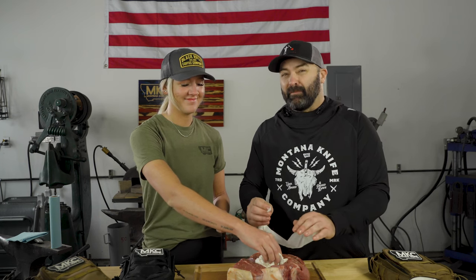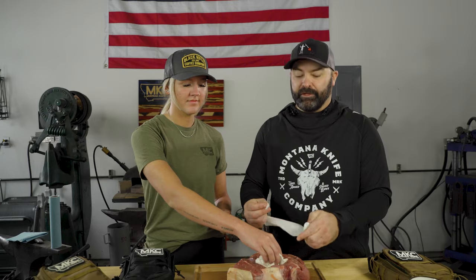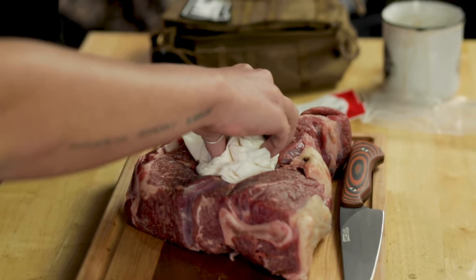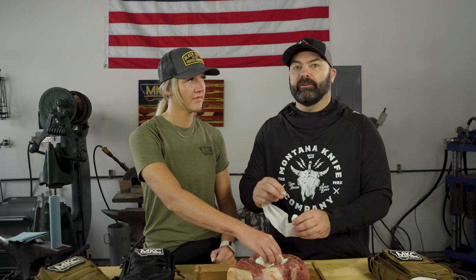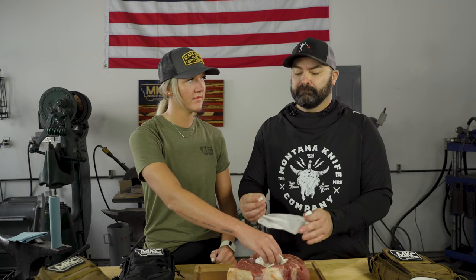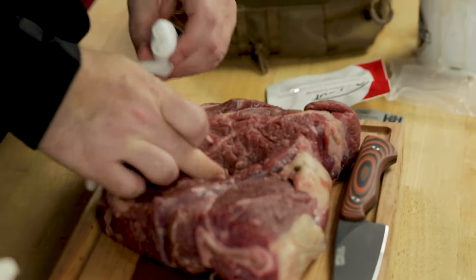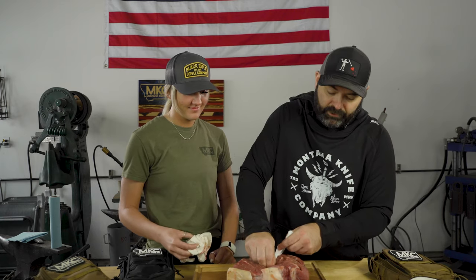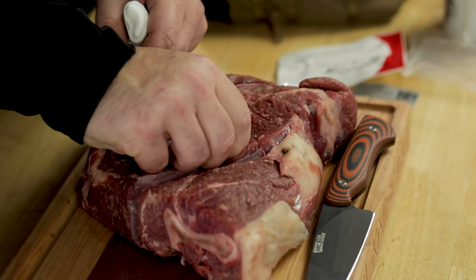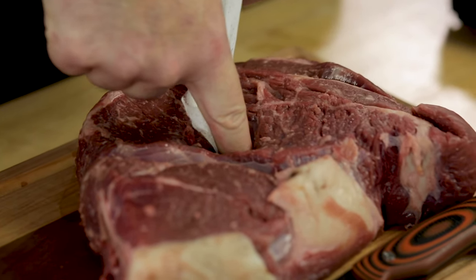Sadie is doing an excellent job of mopping up that blood and putting pressure on there to keep it from bleeding more. She hasn't actually stopped the bleeding. As soon as she lifts her hands away, I'm going to take that corner and put my hand with that gauze into the wound, feeling for the actual source of the bleed — whether it's an artery or vein. It'll feel like the end of a hose. And I've found it.